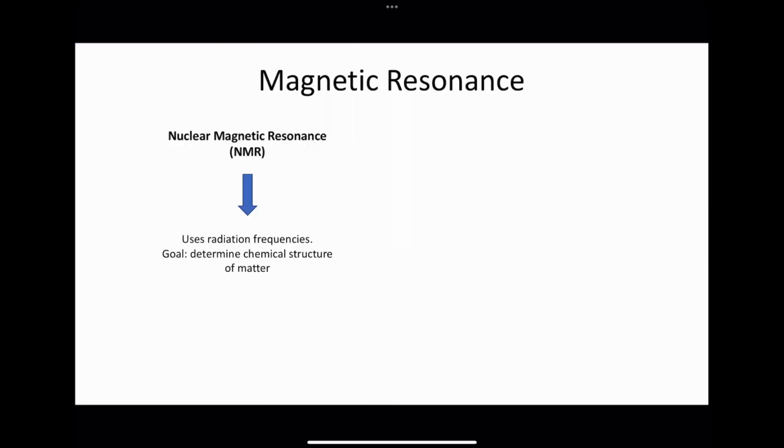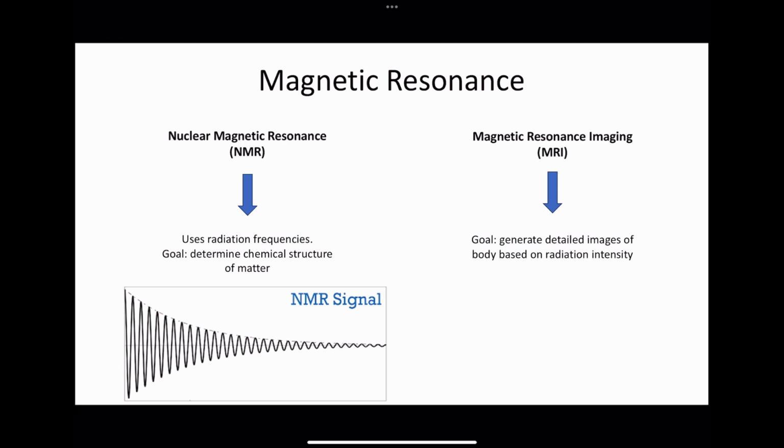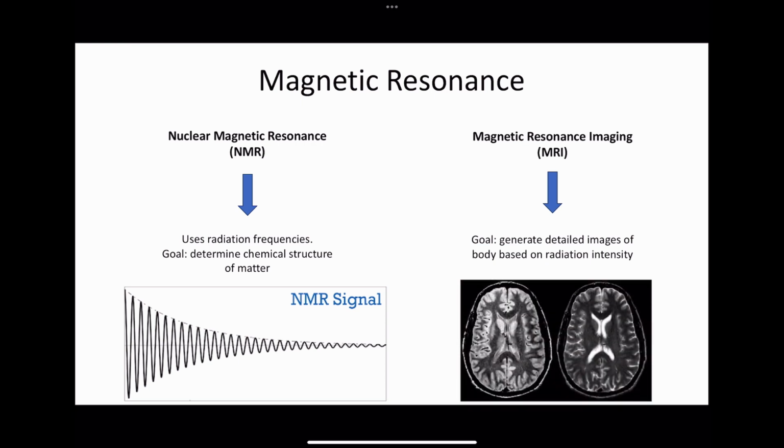Starting off, what is magnetic resonance? Magnetic resonance is essentially the absorption or emission of electromagnetic radiation by electrons or atomic nuclei in response to the application of certain magnetic fields. As you can see here, magnetic resonance imaging, noted as MRI, is based on the principles of nuclear magnetic resonance, NMR, a spectroscopic technique used to obtain microscopic chemical and physical information about molecules. MRI is based on the absorption and emission of energy in the radio frequency, RF, range of the electromagnetic spectrum.